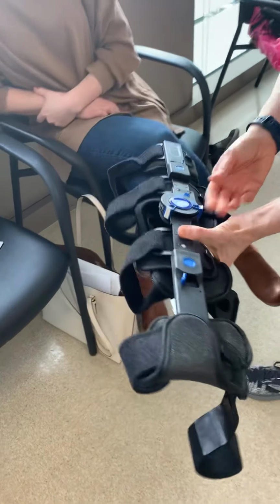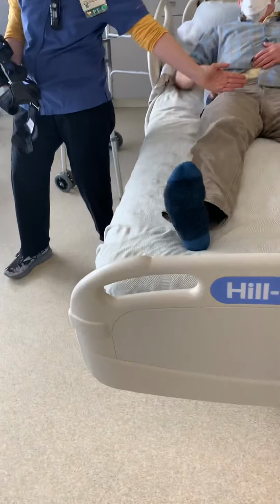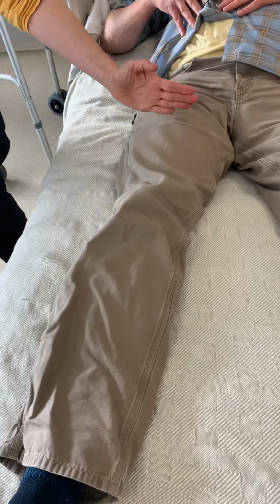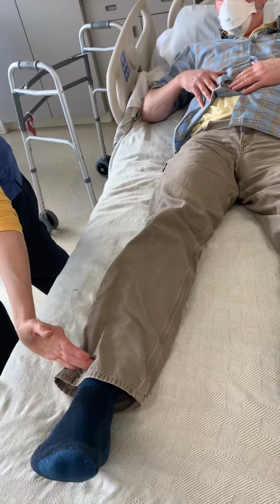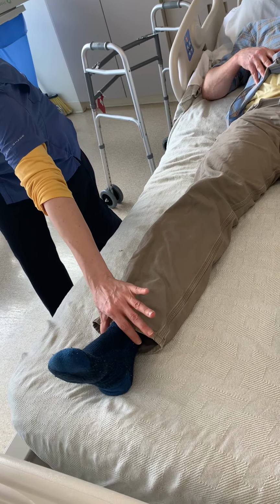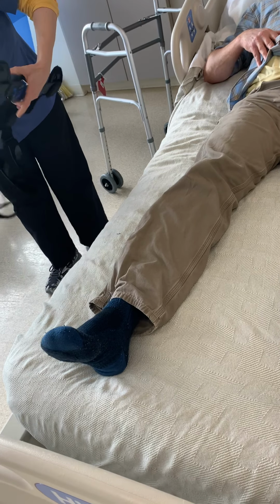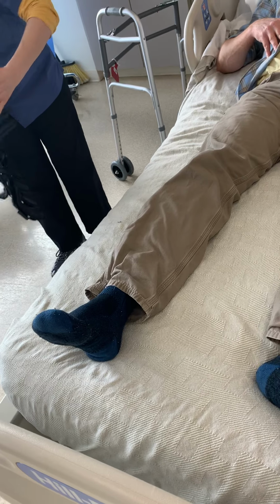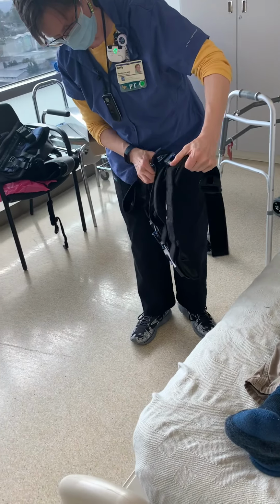When you're looking at the length on the patient, it's going to hit them roughly towards the groin area, so you want it a little lower than that, down to roughly around the malleolus. You don't want it riding right on the malleolus if possible, just a little bit above there would be good. So with Joel, we're just going to estimate here.